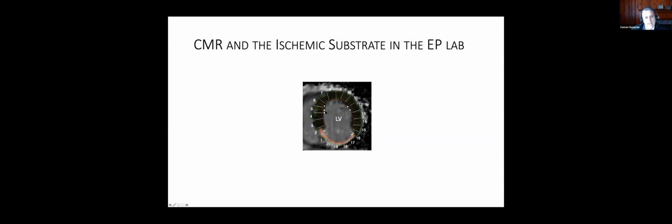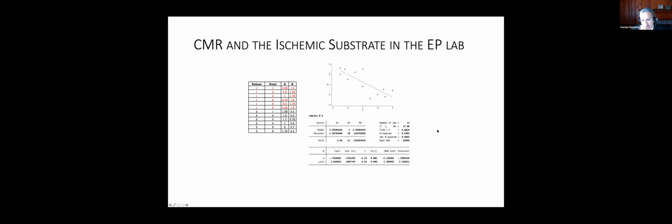We took electrograms, we took their XYZ coordinates in space, and we registered them to the images. And this, you can imagine, is quite a lot of work. You want to make sure as best as you can to register these images, align them properly. And then once we did that, we would take the data. And here I want to point out that more and more of this kind of work is being done, and you really have to take care to do the right analysis.